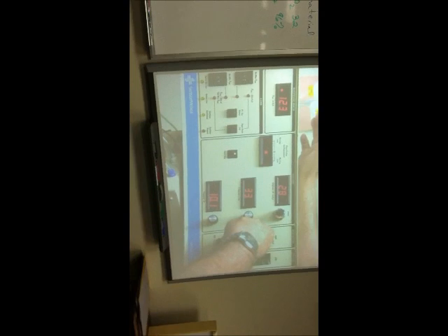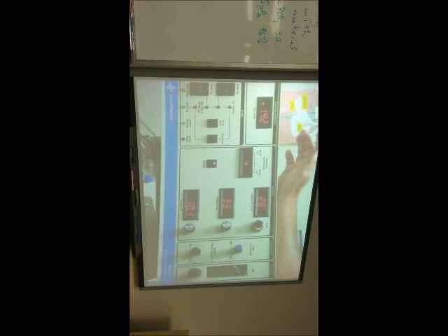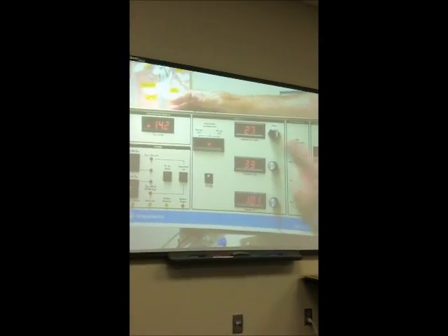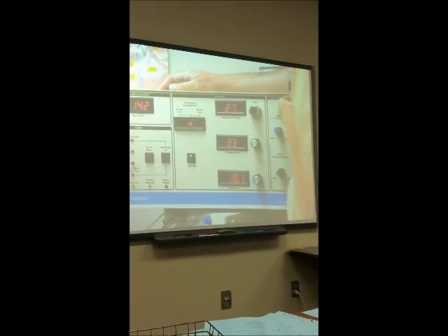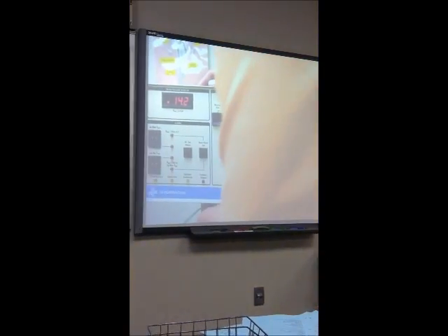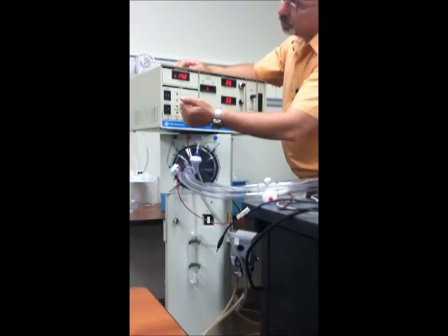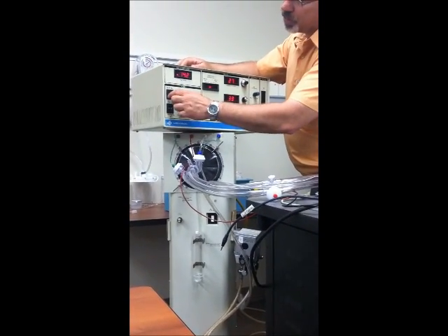There it goes, so I'm going to cock it back this way. I don't know what number this is set. There's no number here. It's just a little bit higher than where this one's set. I do know that. And then I want a mean airway pressure of 14. I'm probably going to take this up to 9 and maybe take this up to 22 or something like that.